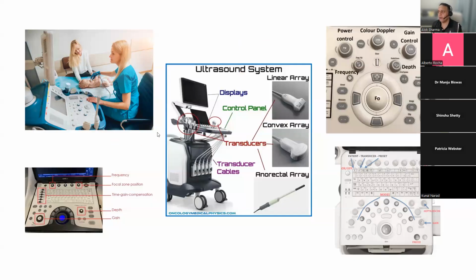So we've talked about frequency, depth, focus, and gain. I'm not covering time gain compensation just yet. I will cover it when I cover advanced ultrasound physics. But any questions? Feel free to unmute yourselves. Feel free to talk over each other.